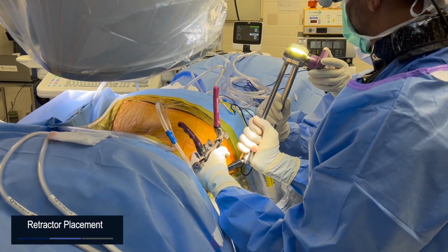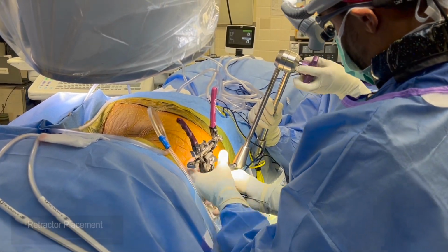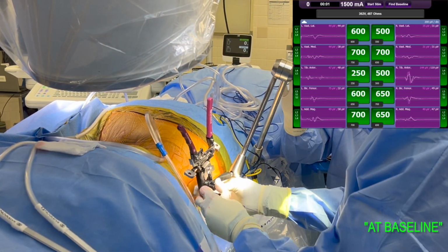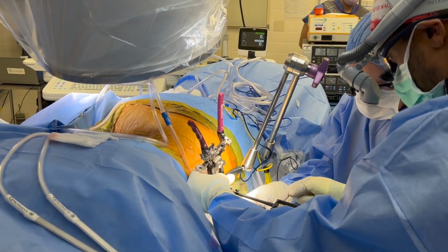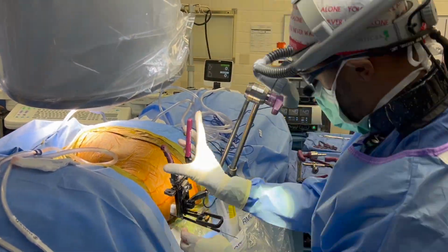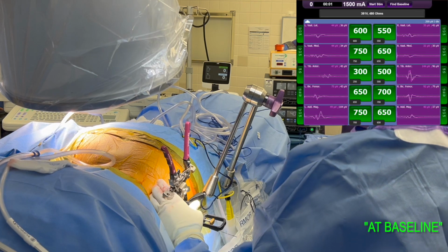Perfect. X-ray. Again. Angle looks great. Run a TMAP. Okay, running TMAP. And baseline. Thank you. Grab the string. Put the extra small. I'll grab the string. Run a TMAP. Okay, TMAP. X-ray. Now. And baseline.